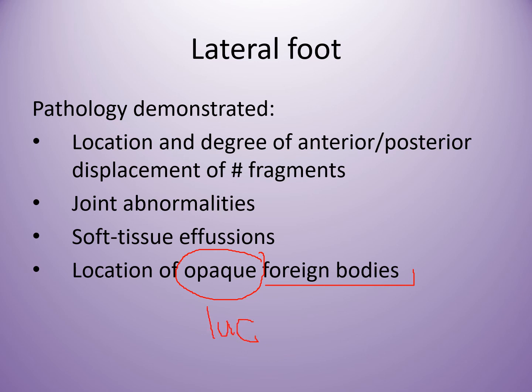Lucent is the one that cannot be seen on the radiograph, whereas the opaque can be seen on the radiograph. For example. Okay. We discuss it like that. What is this symbol? Fractures.